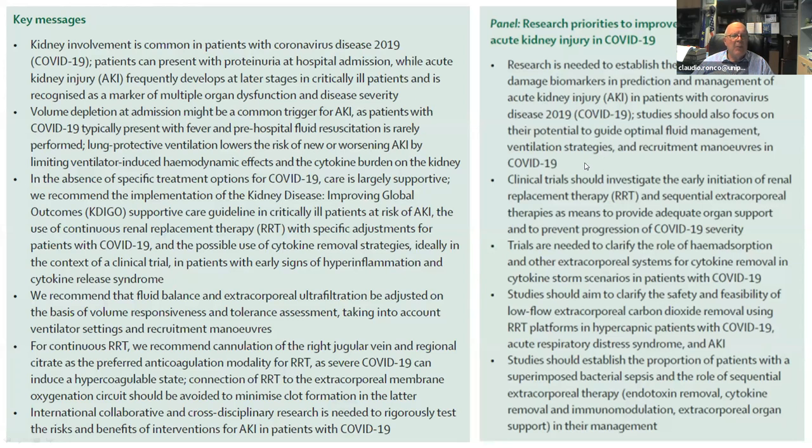Now, in the paper, we gave specific information, but also we suggested research priorities. Research needs to establish the value of new biomarkers. Clinical trials should investigate the early initiation of different extracorporeal therapies and what we call sequential extracorporeal therapies, which starts with the possibility of removal of endotoxin if superimposed sepsis is present, followed by removal of specific cytokine patterns with different patients that have cytokine storm scenarios. And finally, the feasibility also of extracorporeal CO2 removal in this patient.